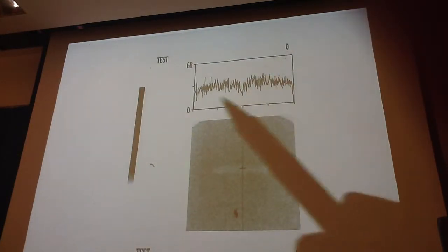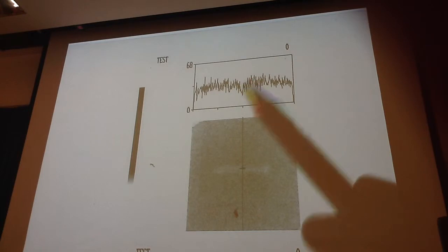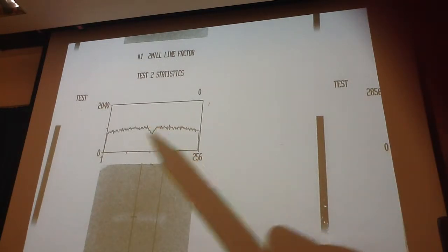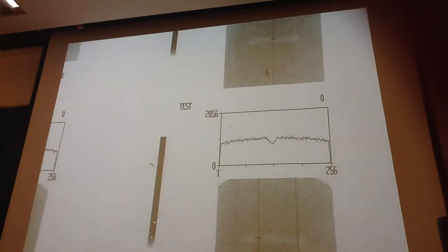But I just wanted you to see, now over here again, here we have a noisy image, but you can kind of see that the object is there. And as we get more statistics on it, the object starts sticking out better from the surrounding stuff.